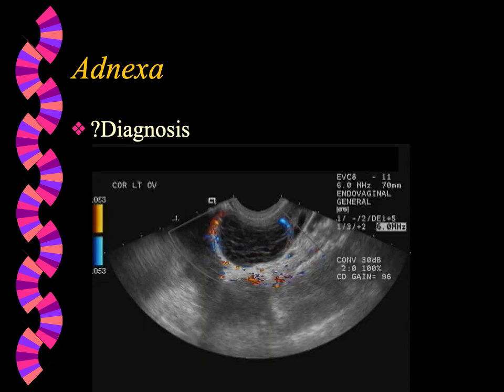As we do her ultrasound, what we see is this cyst, which could appear to have multiple septations within it, but what this actually represents is hemorrhage within the cyst. So this is actually a hemorrhagic corpus luteum.